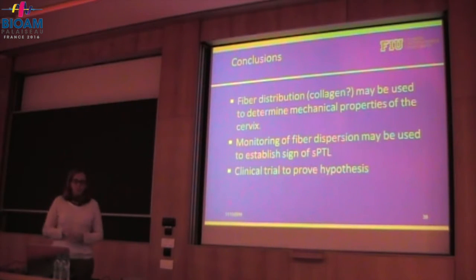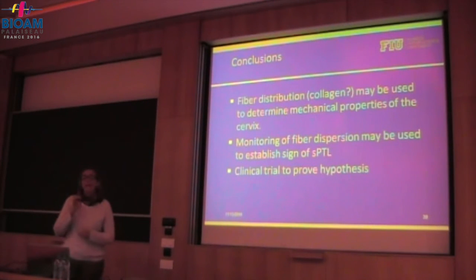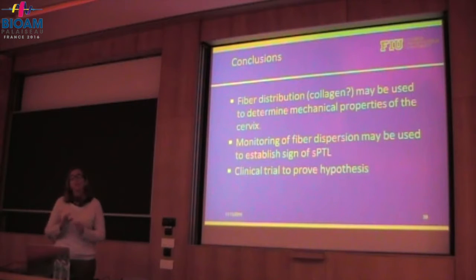Right. Yeah, so two things. The pressure that we impose is 30 millimeters of mercury, so if you gently touch yourself with your finger, that's 30 millimeters of mercury. So you're not yanking on the animal. It's a very low pressure, and that pressure is actually used to limit the blood. It's used to create a hypoxic condition. So you're basically squishing the capillary network. You're not really imposing a great deal of pressure on the collagen. And so that's why pressure is imposed.